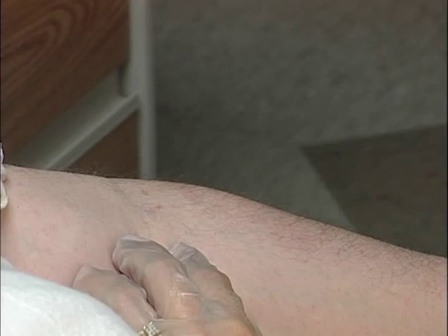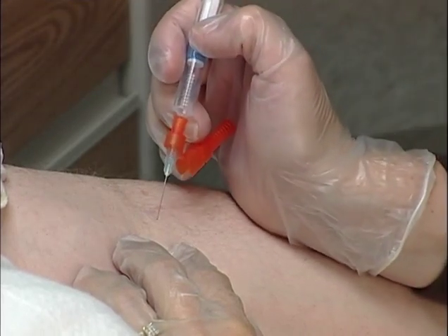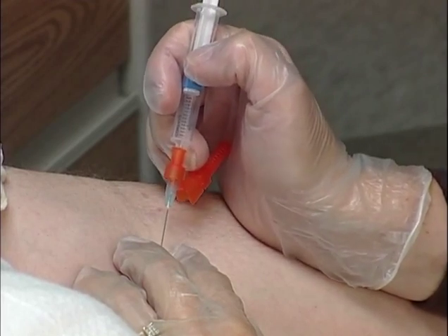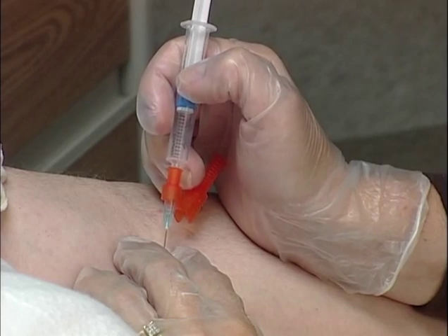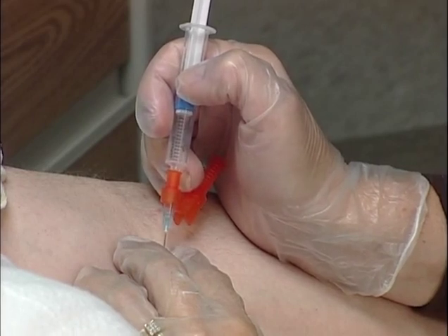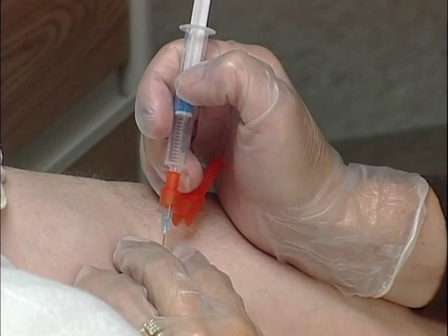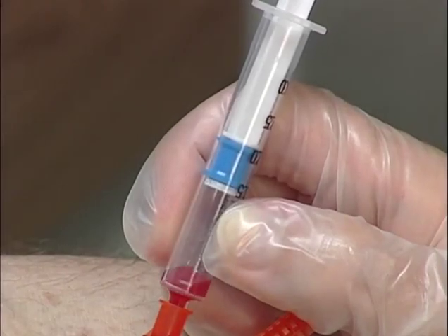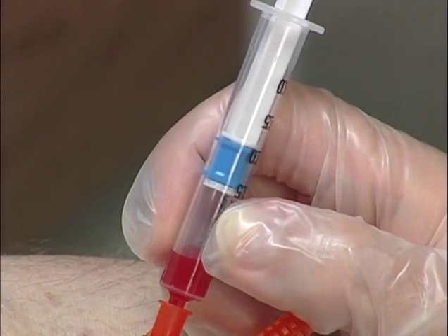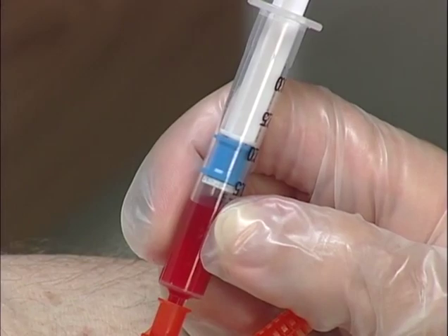If performing a brachial puncture, cleanse the site and anchor the artery from above and below the intended puncture site with the index and middle fingers. Insert the needle slowly and steadily at 45 degrees or less between the pulses felt by both fingers. When blood enters a syringe, stop advancing the needle and keep it in position until an adequate volume has been obtained.